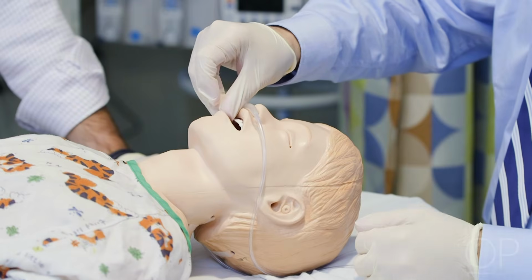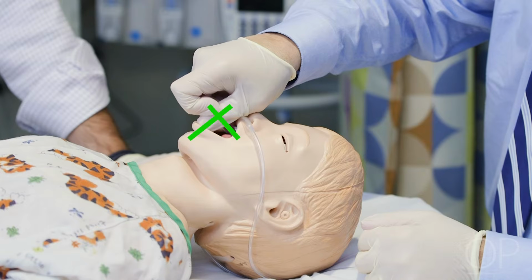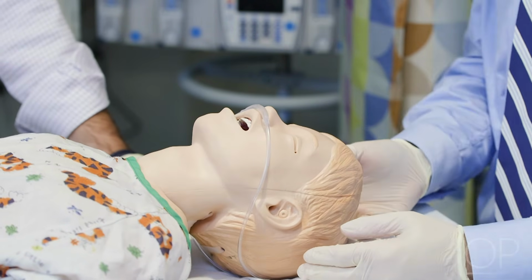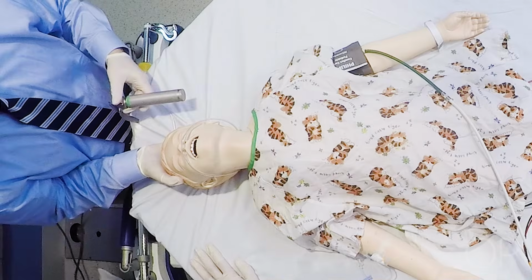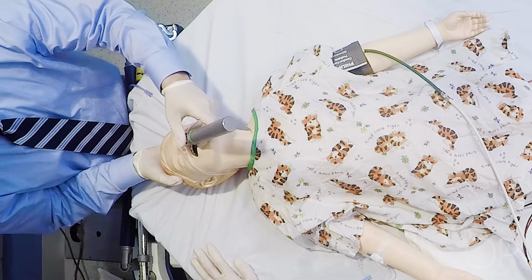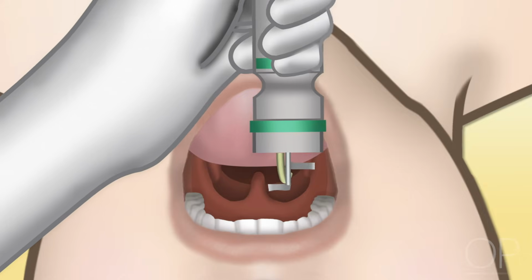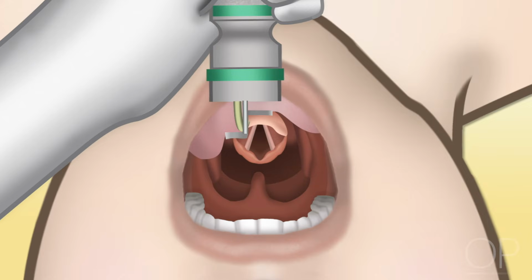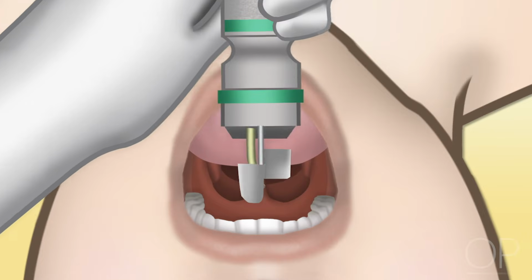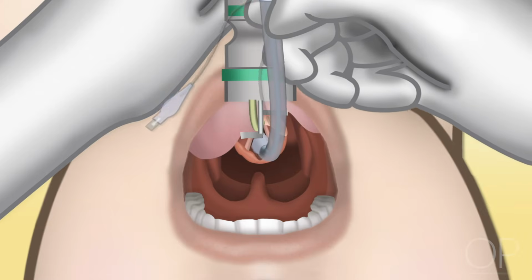Appropriate technique should be applied to open the mouth prior to inserting the blade. A scissoring technique, or rotation of the head backward in a neuromuscularly blocked patient, can be effective. The blade should be smoothly inserted from the right corner of the mouth using the left hand to hold the laryngoscope handle. The tongue should be swept to the left to optimize the laryngeal view. An alternative approach of inserting the blade down the midline may also be effective, particularly with intubators with less experience.